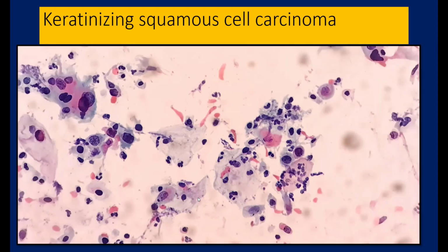So this is a picture of keratinizing squamous cell carcinoma. No guesses. I mean, it's just absolutely clear cut. You've got very pleomorphic cells. Look at the chromatin, extremely hyperchromatic cells. Sometimes the cells with opened up chromatin, creating so-called chromatin lakes. Variety of chromatin, and you can see keratinization, some degenerated nuclei. These cells otherwise would be cells of HSIL, right? So this is a classic picture and some degree of tumor diathesis in the background.